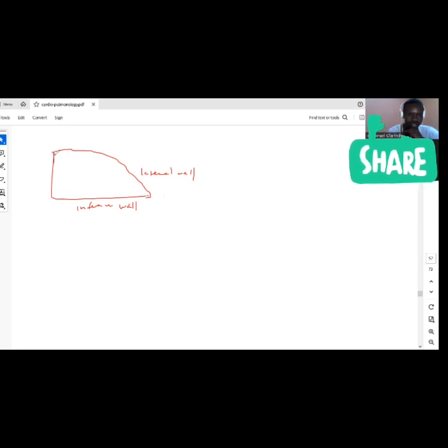Assuming this is your left side, this is the right side. The head is here, the legs down there. And on this right lateral surface, definitely that will be the right ventricle. Lateral wall typically corresponds to the left ventricular wall and the apex of the heart.